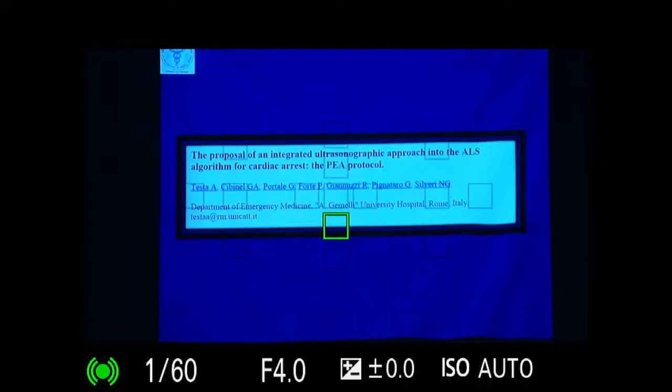You can integrate that because machines are getting smaller, and you can use them on battlefields, in pre-hospital care, in jungle warfare, where pneumothorax is a key issue, and in disaster management, where patients are in the rubble. One of the key killers in earthquakes is pneumothorax. Or you can even do it in non-arrest situations, for amputation, blocks and all that stuff.